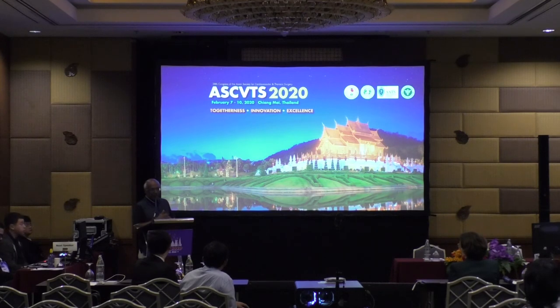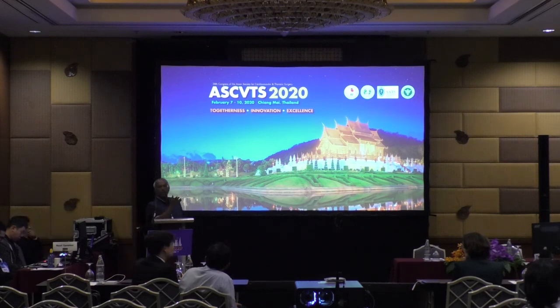I worry about this epidemic of GLS. At least with the EF, if I show you a four chamber and I say, what is the EF? We all have an idea. If I measure it and it's 30%, but your eye is telling you it's 55 or 60%, clearly you question it. With GLS, there is no way of telling whether that number is right or wrong. There is a way to do it, but we don't do it. That's a problem, and I think that internal validation is important. Anyway, any other questions? I don't want to monopolize the conversation.